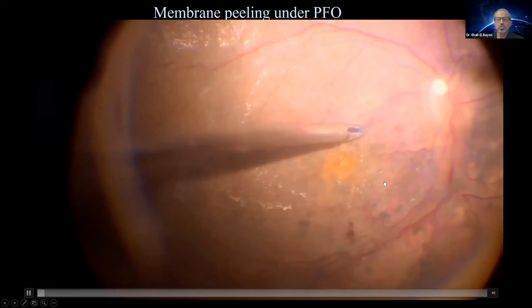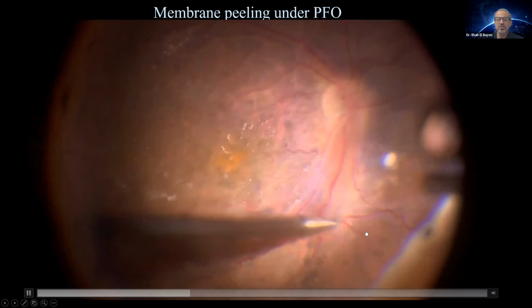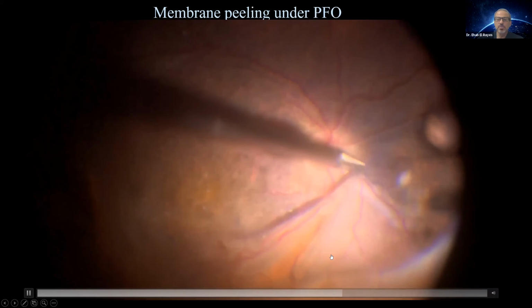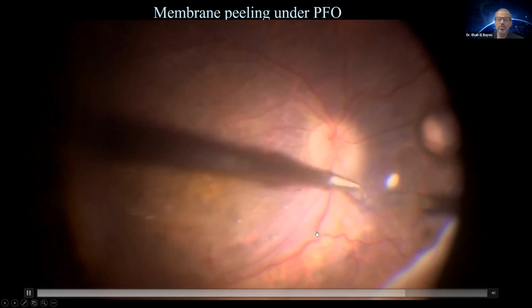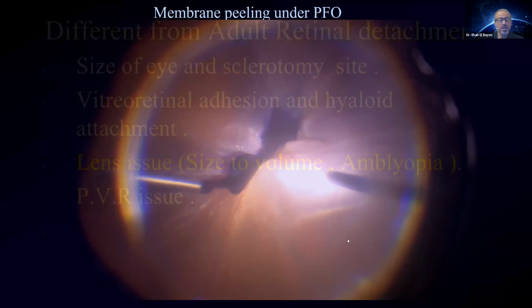The same trick, you could use it if you put perfluorocarbon first. It helps you to remove the ILM or even remove epiretinal membranes. I always like in pediatric age group to have some support inside the eye. Though they have more elastic retina than adults, still you can easily create breaks, and in pediatric age group we try to avoid that, so you have to use what is comfortable in your hands to make that step safely done.